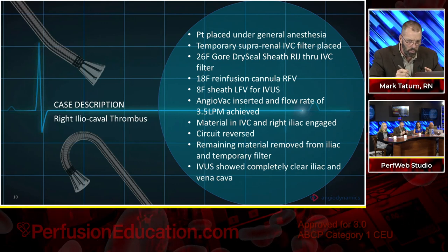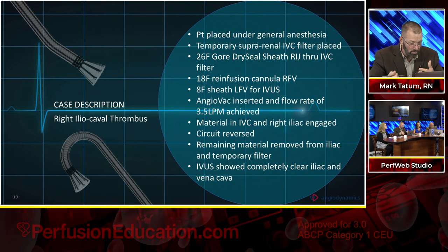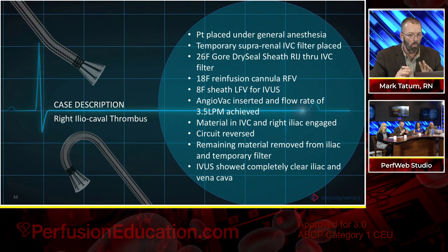And the average pump time on those is roughly 4 minutes. If you flip over to these cases, your IVC cases, these last much, much longer for a variety of reasons.